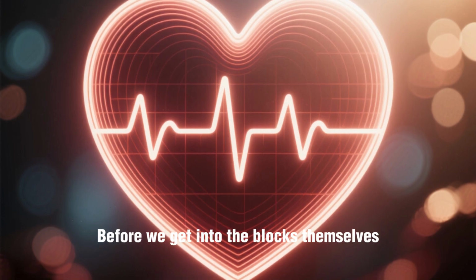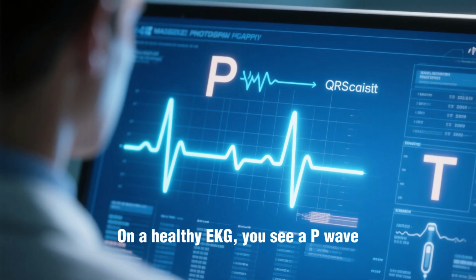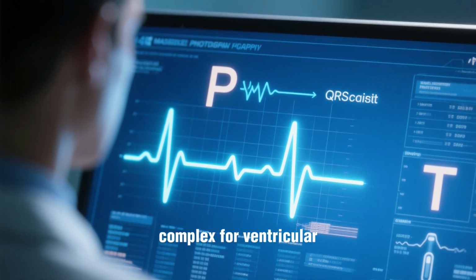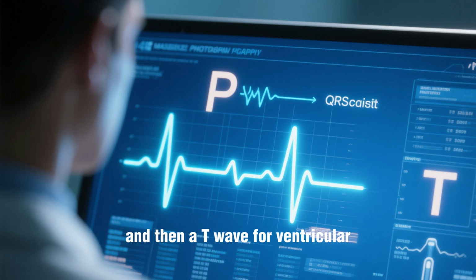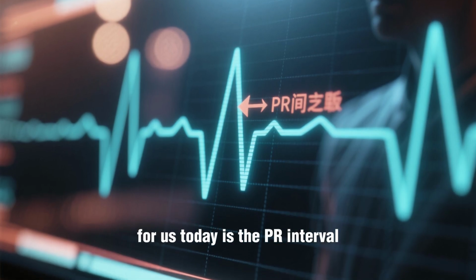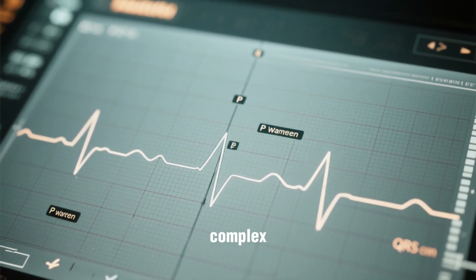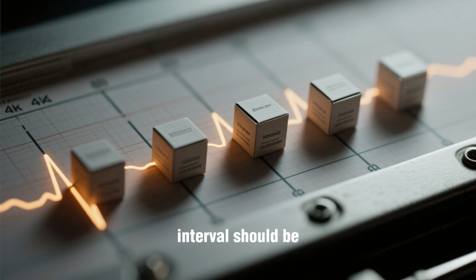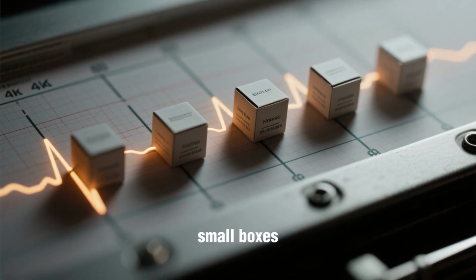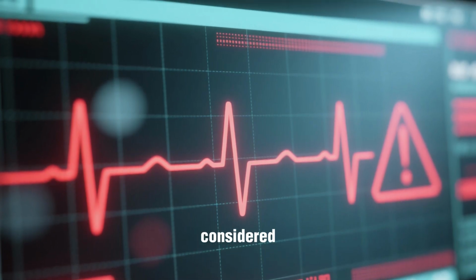Before we get into the blocks themselves, let's do a super quick review of a normal sinus rhythm. On a healthy EKG, you see a P wave, which is atrial depolarization, followed by a QRS complex for ventricular depolarization, and then a T wave for ventricular repolarization. The key measurement for us today is the PR interval. We measure this from the start of the P wave to the start of the QRS complex. Normally, this interval should be less than 200 milliseconds, which on EKG paper is less than 5 small boxes. If that PR interval stretches out beyond 5 small boxes, it's considered prolonged.